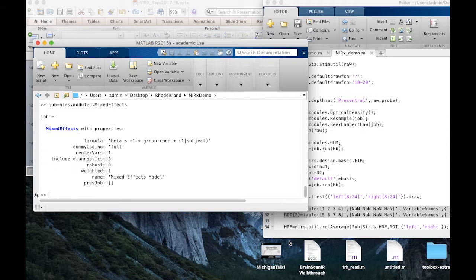And so we can specify complicated formulas with quadratic terms and so on, random effects, fixed effects, etc., and then run our model. The reason we do it in the code here, so you could, as I said, copy paste, stick it in SPSS, and run it in your own way. However, SPSS knows nothing about the covariance between oxy and deoxyhemoglobin. It knows nothing about the spatial covariance, that these two channels on my head had shared noise terms. And so doing it here, I'm actually doing it in a way that controls for that, and which is something that SPSS can't do. In SPSS, you can do weighted, but you can only deal with the diagonal component, not the off-diagonals, which are the oxy-deoxy crosstalk type terms. And so doing it here, in principle at least, is better. In practice, I've not really seen a difference, but in principle, it's better.